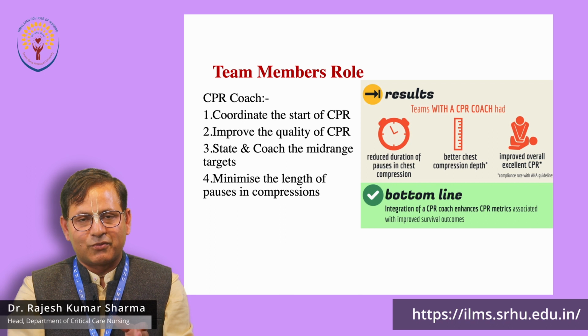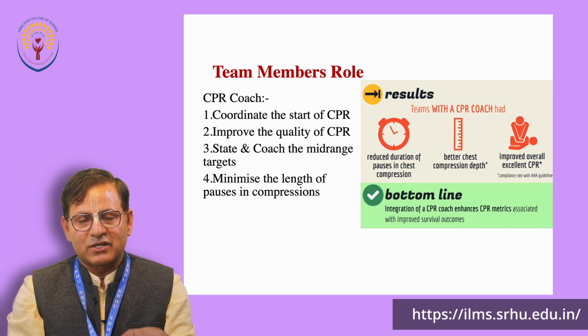We have to see that, for an adult, pediatric or neonate, as per the guidelines, the chest is compressed appropriately, like 5 centimeters in an adult and 4 centimeters in neonates and pediatrics, and we have to see improved overall CPR.